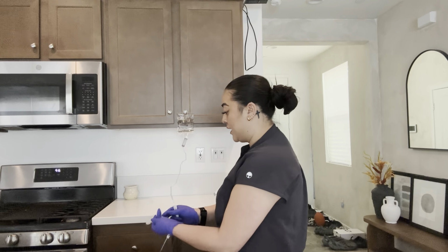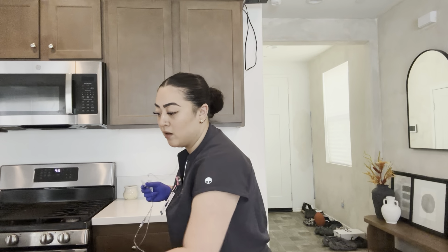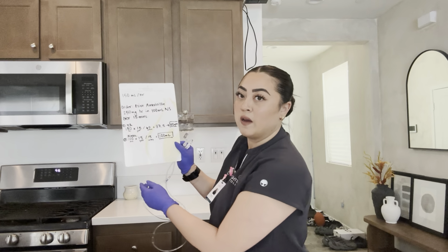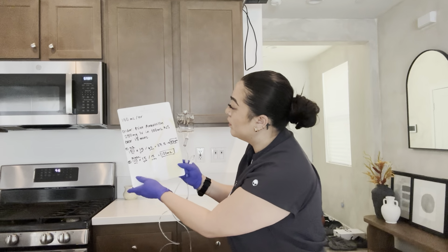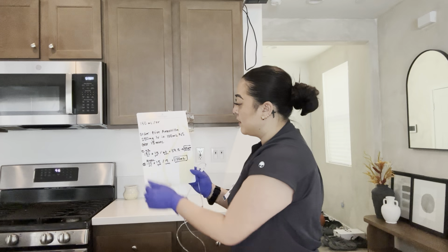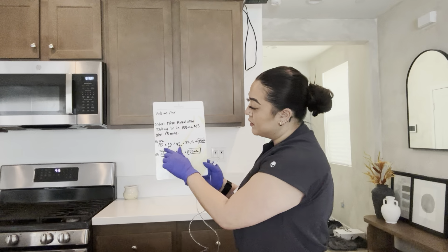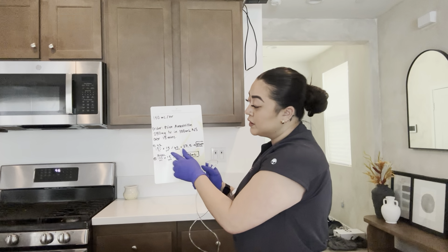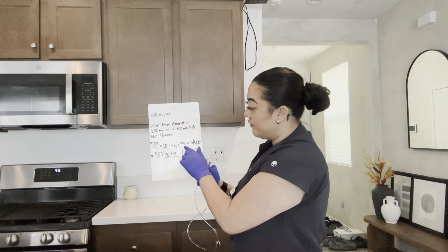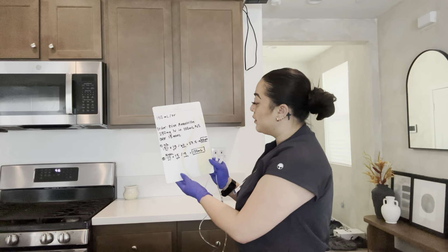So now I'm going to be checking for, and I'm just going to show you here. I did write it down here. So don't know if you could see it, but I'll go over it. So for the fluid portion, it's 150 mils per hour. So the way that you would do the calculations is you would take the 150 mils, multiply it by the drop factor, which is 15 drops, and then over the course of an hour, which gave us 37.5. We can't use halves, so we're gonna round that up to 38 drops.